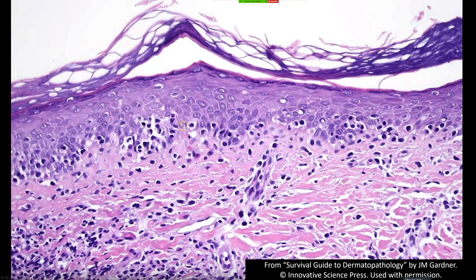What we're seeing here is lymphocytes tagging — scattered along the basal layer of the epidermis. When they do this, they tend to get little vacuoles around them, sometimes called halos. This tagging of lymphocytes with halos along the basal layer is really helpful. Now, you might notice that looks a bit like vacuolar interface dermatitis — and you're right, it kind of does. What really helps distinguish it: MF usually has a lot of lymphocytes but not much reactive response — not much spongiosis and not many dying keratinocytes.